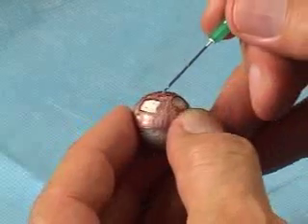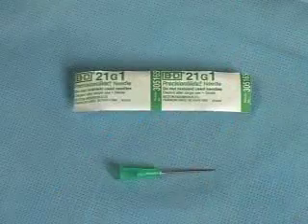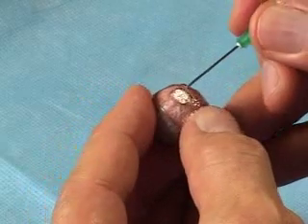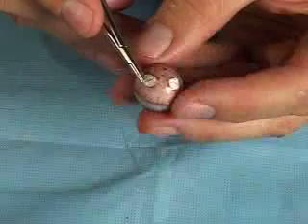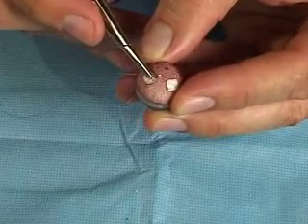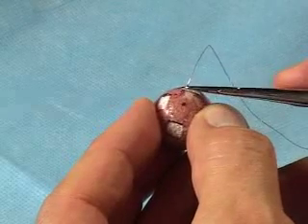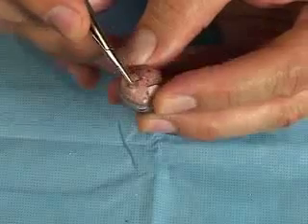Once the windows have been created, an important technique used to make the passage of the suture needle easier is to create a tunnel or tract from the suture exit hole to the muscle window using a 21 or 25 gauge hypodermic needle. Simply place the point of the needle in the suture exit hole and while twisting the needle, push it toward the corner of the muscle window. Angle the needle toward the implant to avoid breaking the bridge of polymer between the exit hole and the window. Use a trial needle like the one attached to the sutures used to tag the muscles to verify the needle track. I use an S14 quarter circle spatula needle. Pass the needle from the muscle window to the suture exit hole, hugging the underside of the coating. You may need to break a few spicules of hydroxyapatite as you do this. Pass the trial needle through each of the suture exit holes to assure easy passage of the needle tagged to each of the rectus muscles.